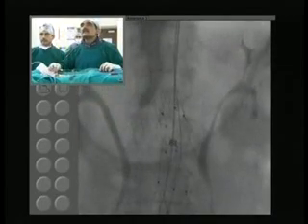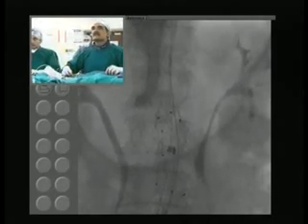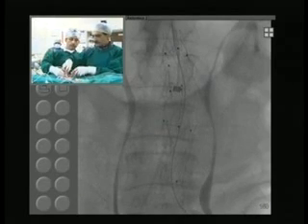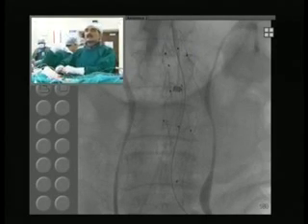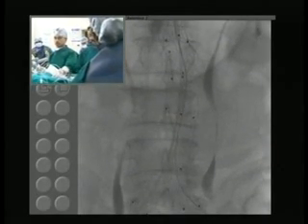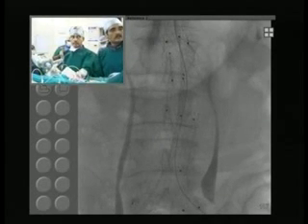No, go back to that previous view so that we can see everything. Show the catheter. There's the catheter. Show the pigtail. It's on top. Come down. Okay. Now show the whole thing in one view. Table up maximum and tweak. Okay. All right, so we'll pull back the sheets. Are you ready then? Okay, breath hold please. Holding now.